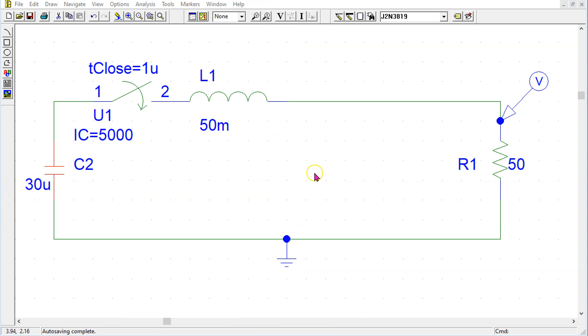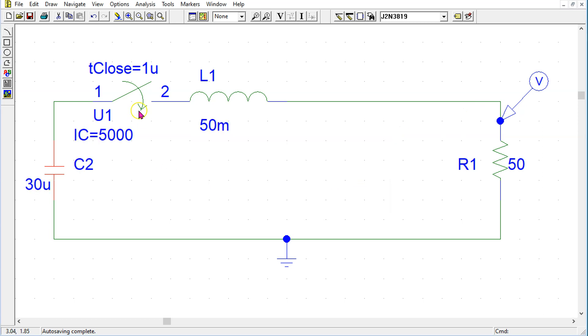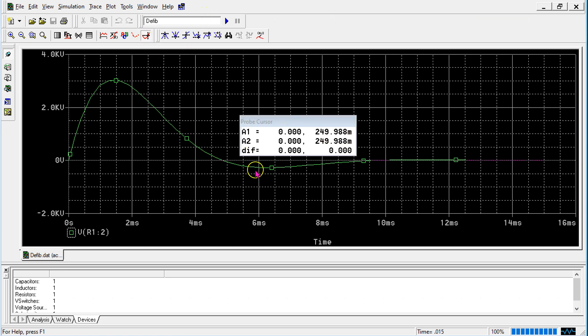This is the same circuit in PSpice. We can double click the capacitor and define the initial condition. We can simulate this circuit and enable the cursor and we can see that we obtain the same waveform as before with a peak of around 3000 volts.